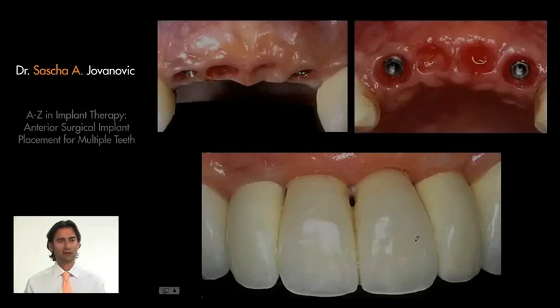And now you can see how I'm able to utilize an ovate pontic design of the bridge to actually bulk out soft tissue and get this kind of creation. So this is really nice, and it allows me really to develop a good ridge. So this is good from a standpoint of soft tissue augmentation, as well as from a standpoint of creating an emergence profile for the bridge.